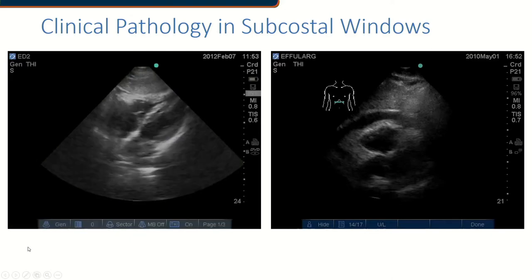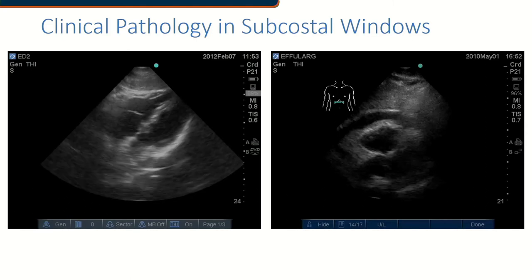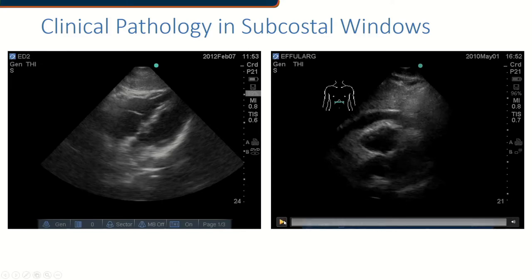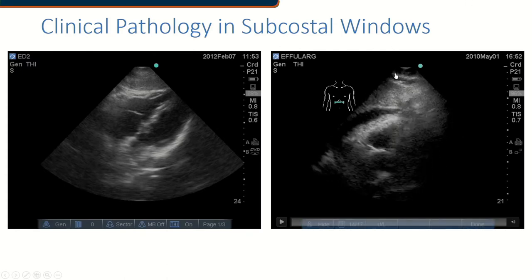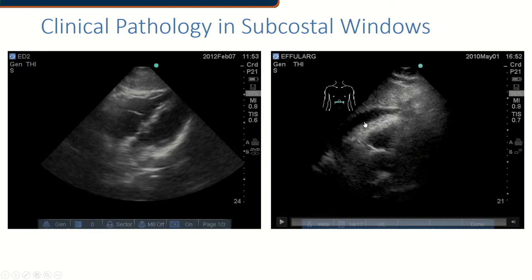Looking at our first video example, this particular window shows a very fast heart rate. We can see the liver up at the top of the screen, and the wedge shape tells us we're using a phased array probe. The probe marker is to the right of the screen — the patient's left side — which is why we see the apex on one side and the right side of the heart and liver on the other. Here you can see a pericardial effusion in this person.